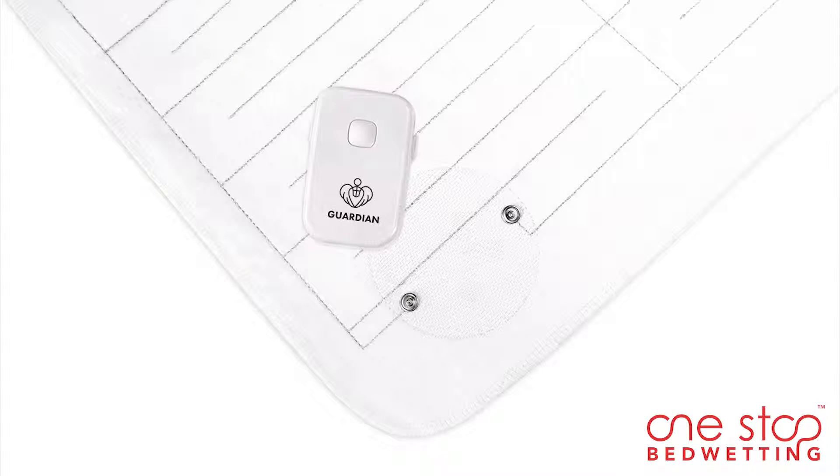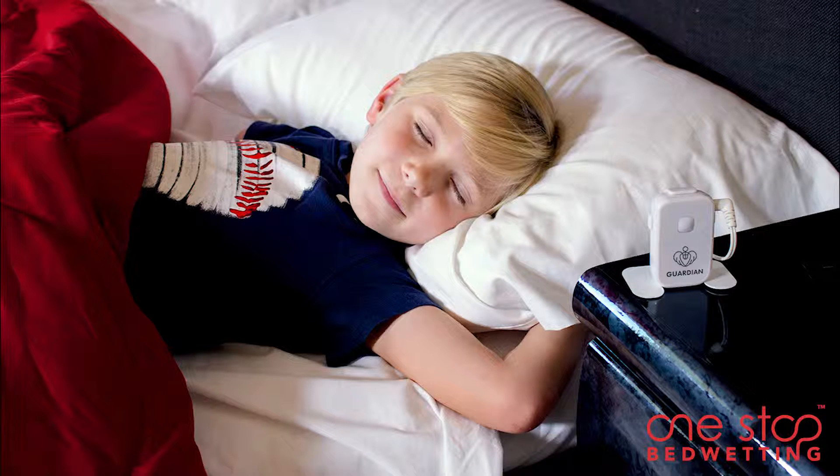The Guardian consists of a compact alarm unit and a reversible waterproof bed mat. Guardian is an easy-to-use bedside alarm which can be easily placed on the side table with the included stand.